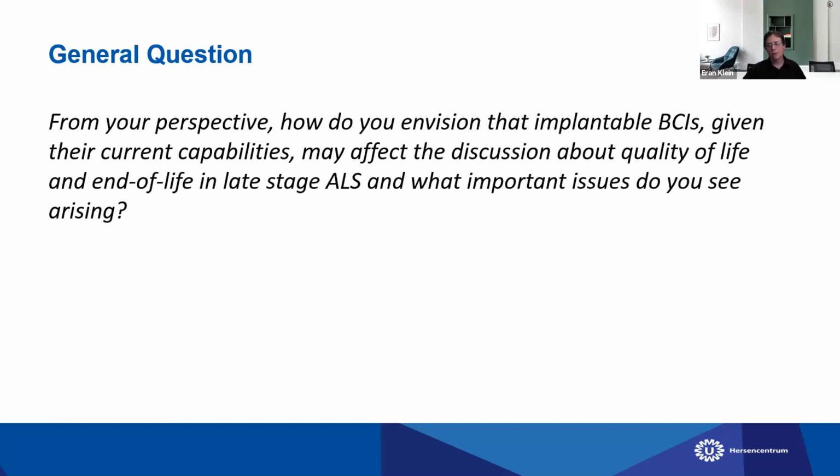Thank you. So I guess I envision the implantable BCI as just presented by Mariska as maybe shifting the conversation about interventions in ALS in a few different ways. The first is around how to present the capabilities of this kind of BCI in a realistic way. This kind of neuroprosthesis offers significant hope for people who may be justifiably worried or even terrified of losing the ability to communicate their needs or just to interact in the way they want to with loved ones. But this is also a population that might be wary of hype and at times who might feel pressure from family, friends, or others to try new therapies.